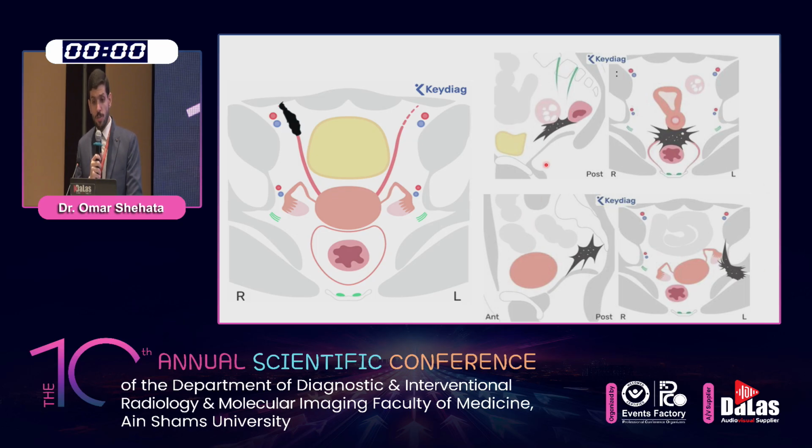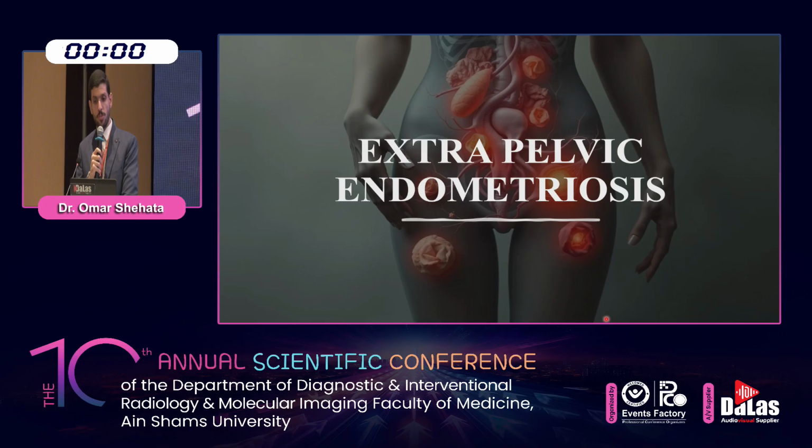Information needed by surgeons in the MRI report for the mediolateral parametrium is a description of the parametrial involvement, as the risk of hypogastric plexus injury is important, and the patient should be informed of the risk of dysuria. Moreover, the extension to the uterine artery should also be evaluated to predict the risk of hemorrhagic complication. For the posterolateral parametrium, the distance or extension to the iliococcygeus muscle of the levator ani is important to describe.